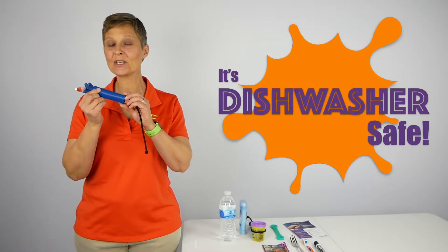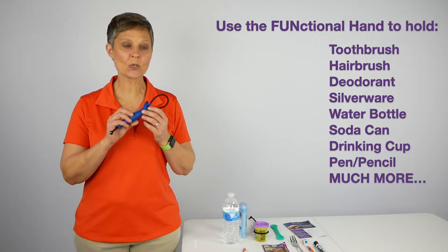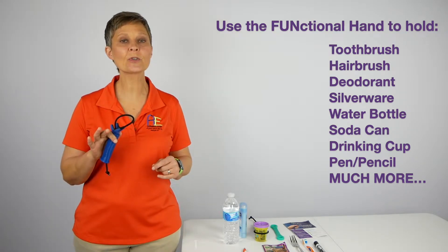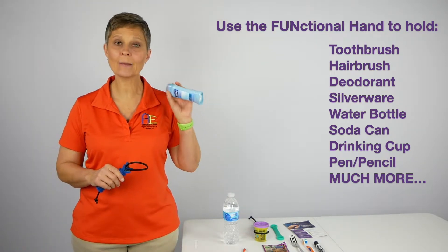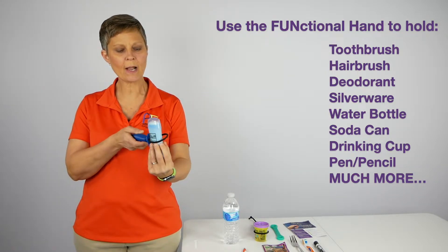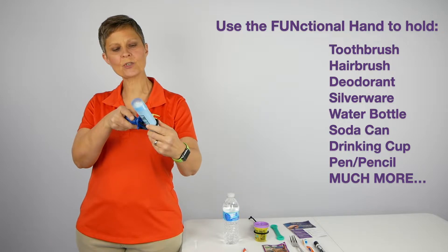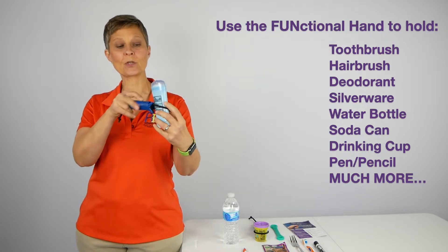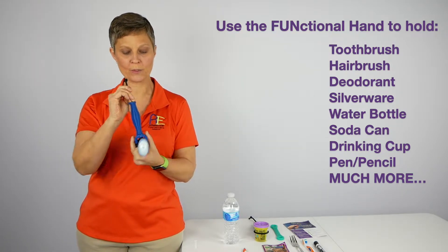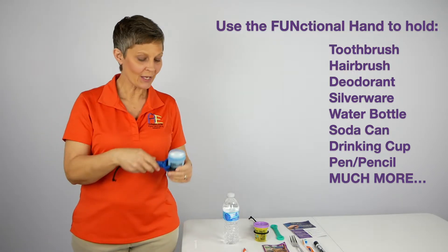And bonus — this is dishwasher safe. I tried using it with several different things. I was able to use it with my toothbrush and brush my teeth, no problem. I was also able to use it helping me apply my deodorant. The deodorant stick actually flipped in the Functional Hand, but it turned out to be a great shape that fit well, and I just pulled the cord tight onto it and it worked just fine.